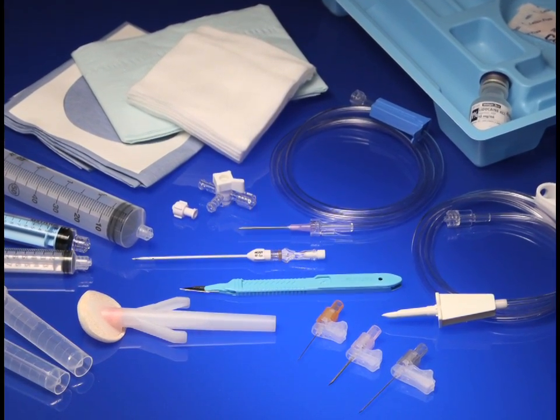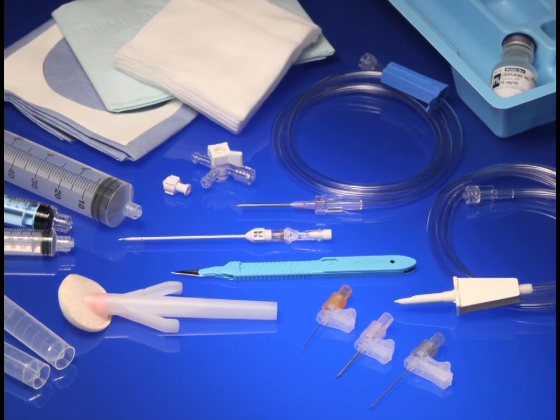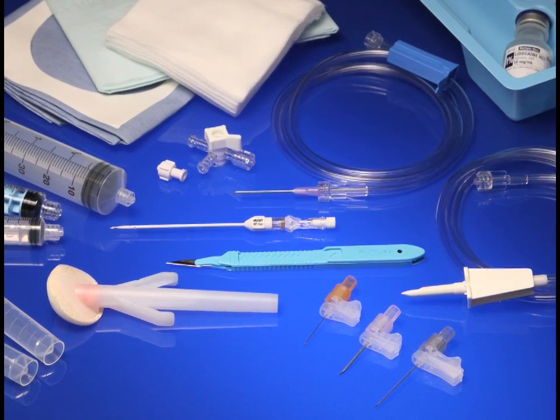To place an order today, contact your local Merit Medical sales representative or visit the Merit Medical website at Merit.com.